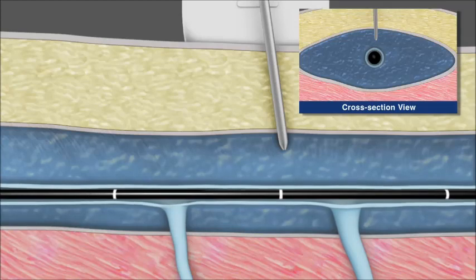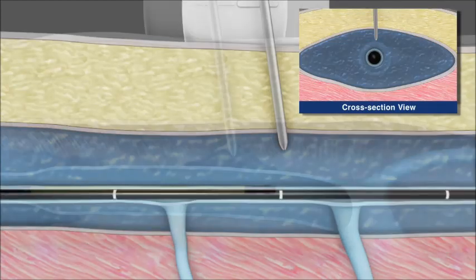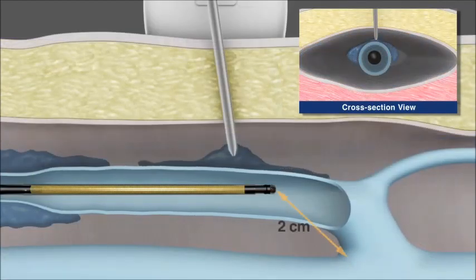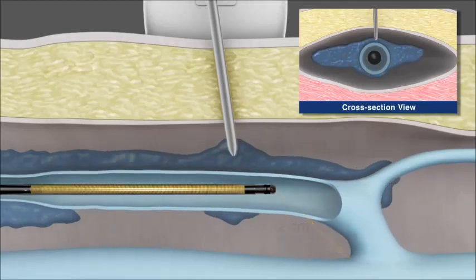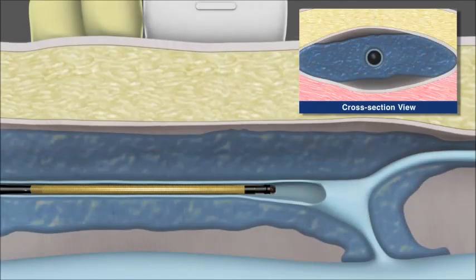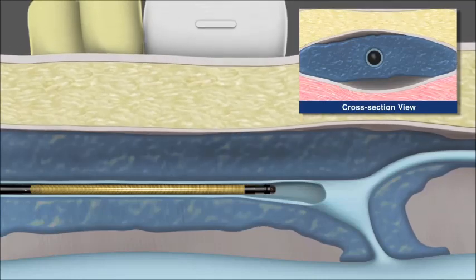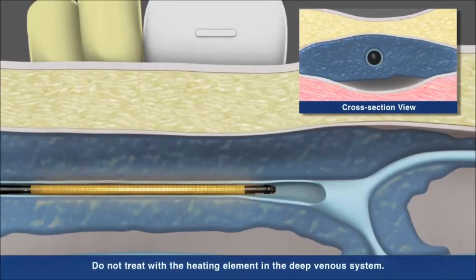The catheter tip position is confirmed and adjusted as needed to ensure the tip is 2 cm from SFJ. Once in place, infiltration of the junction can proceed. External compression is applied to ensure good contact between the catheter and the vein wall.